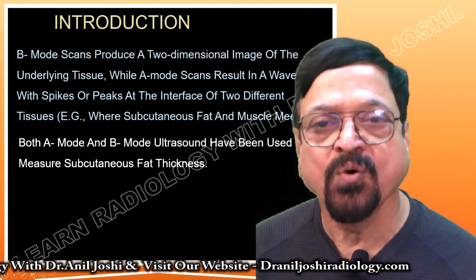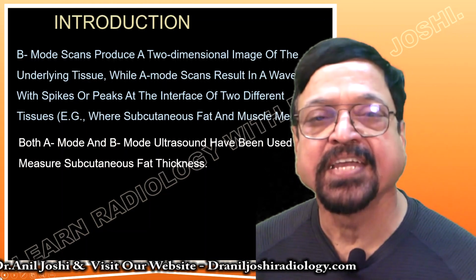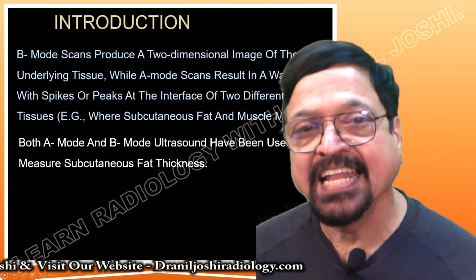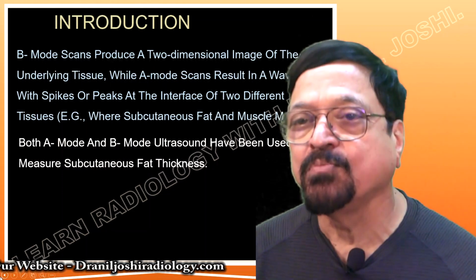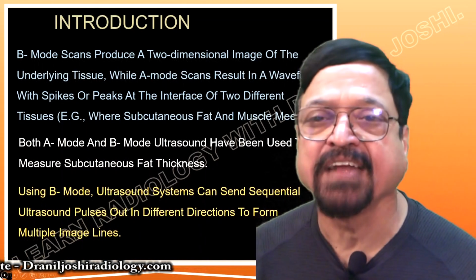So we can know the distance between subcutaneous fat and the muscle. We can know the distance between the lungs and the skin. We can know pneumothorax. So there are still applications used today. Now both A-mode and B-mode ultrasound have been used to measure subcutaneous fat thickness.